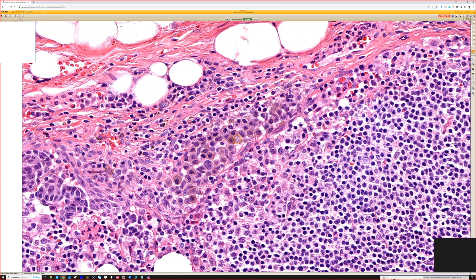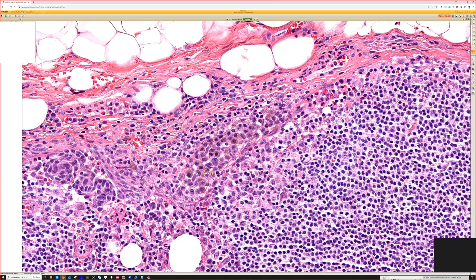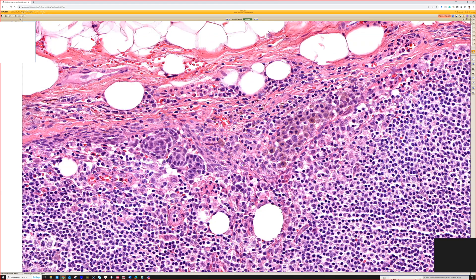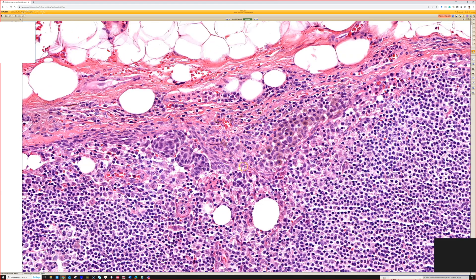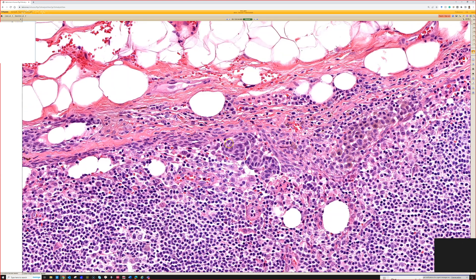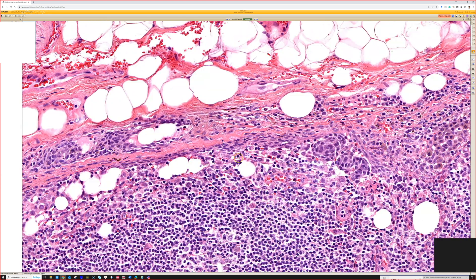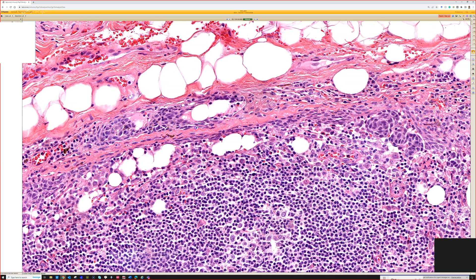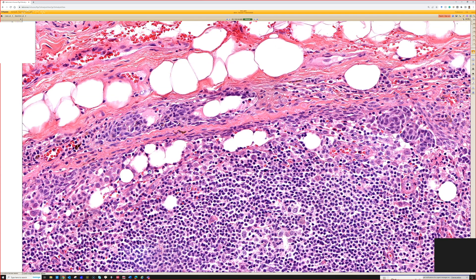You can see in this case pigment production, but you don't always have that. So if you did a stain, you would see that these are melanoma cells, and they're in the subcapsular sinus underneath the capsule of the node - that space between the node parenchyma and the capsule, which is where metastatic deposits of melanoma usually go first.